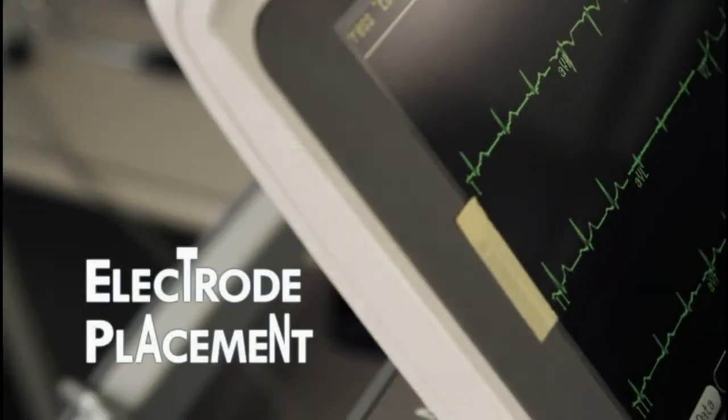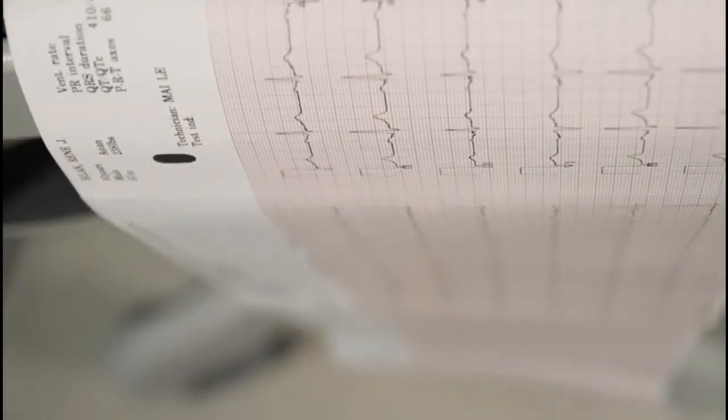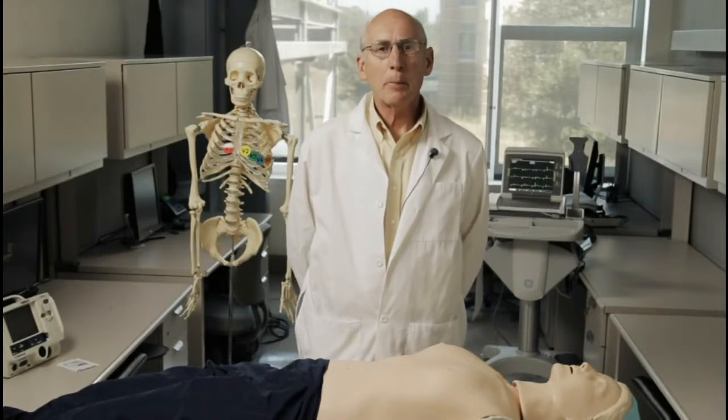Hi, I'm Vic Freliker. I'm a cardiologist and a professor of medicine who has worked with the Stanford athletes for the past 20 years. The electrocardiogram, also known as the ECG or EKG, can be used to screen athletes for heart conditions that can cause sudden cardiac death. In order to make accurate diagnoses, placement of the electrodes and connections of the wires to them is very important. The purpose of this brief video is to review the basics of electrode placement for the ECG.